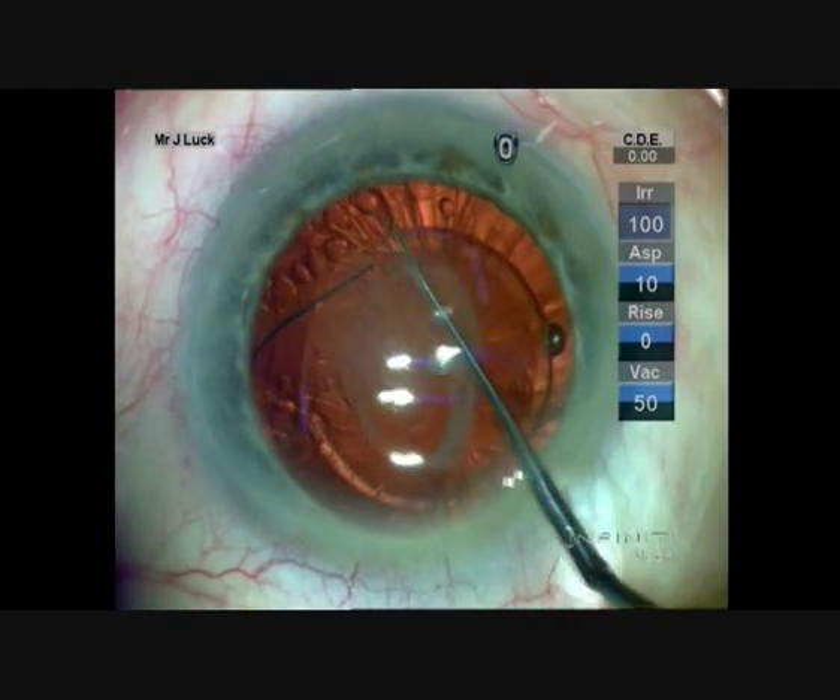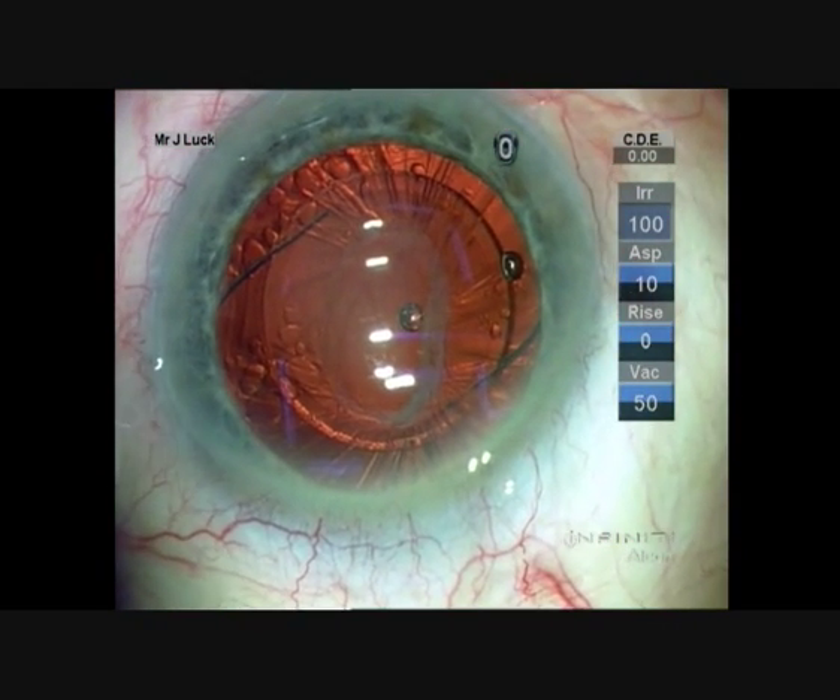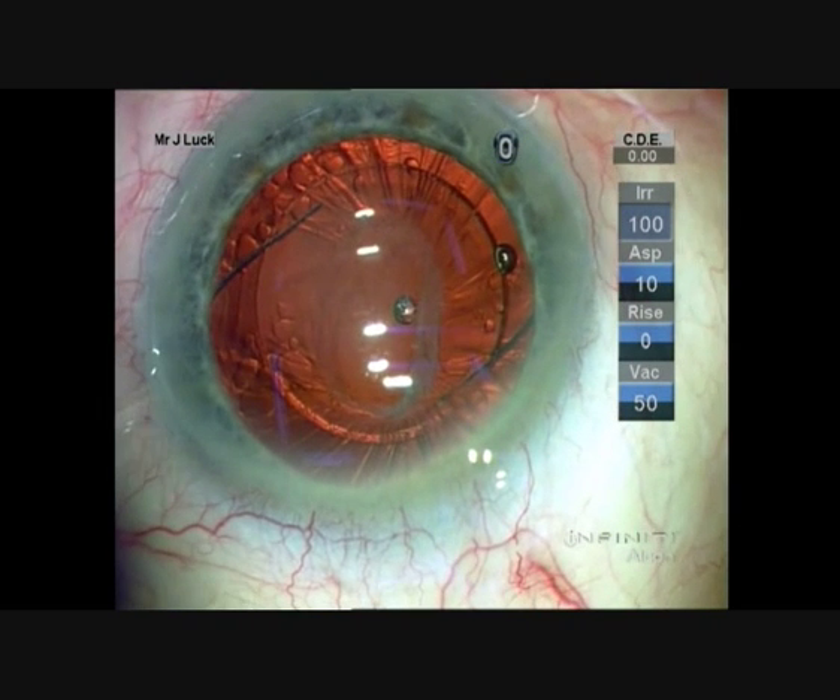At two weeks post-operatively, this lens is nicely centred. There's a clear visual axis and the patient has got improved visual acuity.